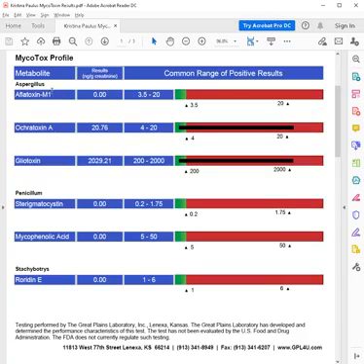Okay, and then underneath where it says metabolite, it says Aspergillus. That is the mold that they find the metabolites in. So this one is from Aspergillus. And so you will find the aflatoxin M1 and ochratoxin A and gliotoxin all under the Aspergillus mold.